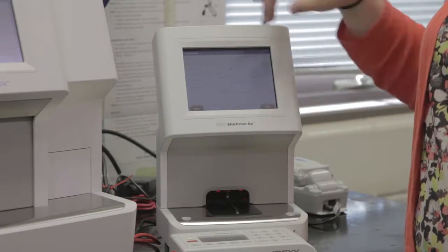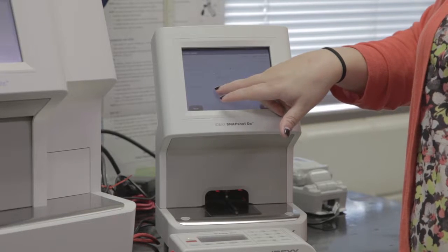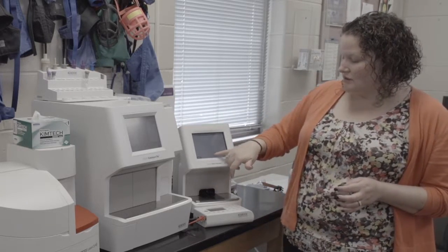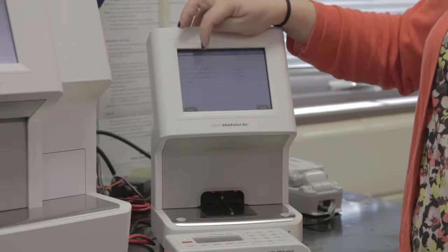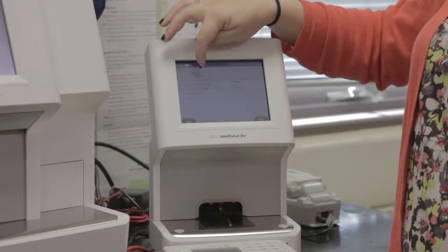You have to tell it what type of sample you're running. My options are serum, whole blood, or plasma. So I'm going to say we're running whole blood. So down here it's telling me to prepare my sample. If you were unfamiliar in practice with how to mix up a heartworm test or any other SNAP test that you're running, it does give you the instructions here. If I tap on this, it's going to jump to a screen that tells me how many drops of sample, how many drops of conjugate, and how I mix it. So that's step by step here.